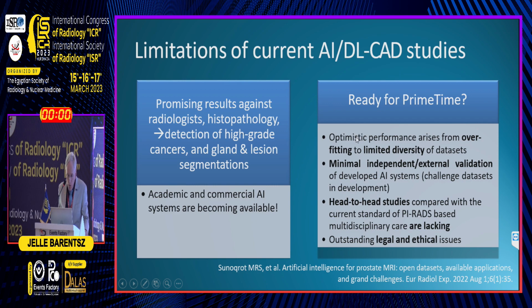No. There is too optimistic performance because of overfitting and limited diversity of data sets. There is minimal independent external validation of developed systems. There are challenges of the data sets. We need to have more and better data sets. And head-to-head studies compared with the current PI-RADS standard based on multidisciplinary care are lacking. And finally, last but not least, who is responsible? There are legal and ethical issues.